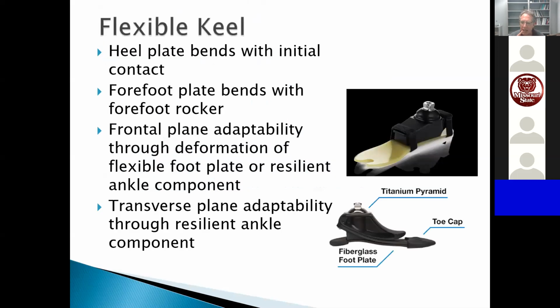Okay, so here is, I don't have an example of this, but in a couple of weeks, maybe you saw this or noticed this on the syllabus, our friend from Ozark B&O, Brandon Sutton, is going to bring in these boots, like cam walkers, that have prosthetic feet on the bottom. And these are the type of prosthetic feet that you guys are going to try walking in. It's kind of a fun activity and also a really illuminating activity.